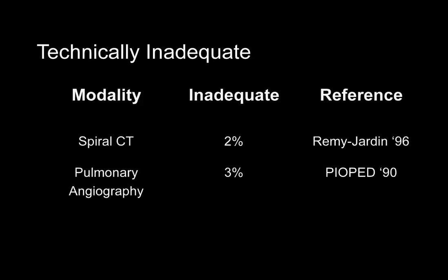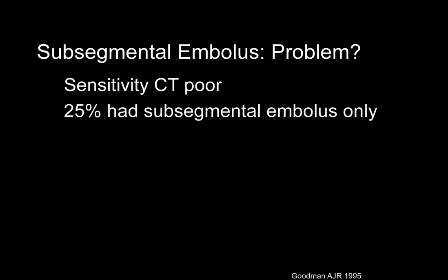Most patients have diagnostic scans. The failure rate is similar to pulmonary angiography. Of some concern is the report that the sensitivity of CT is poor for subsegmental emboli.